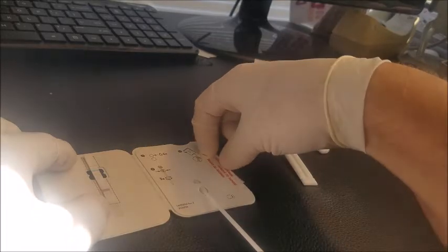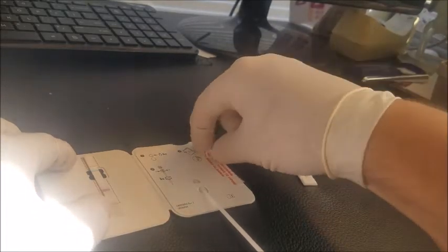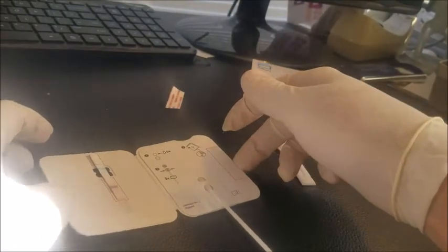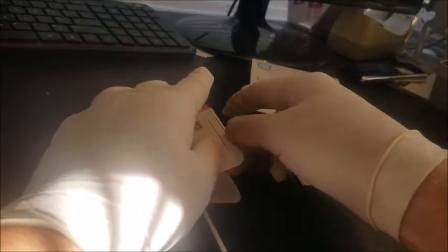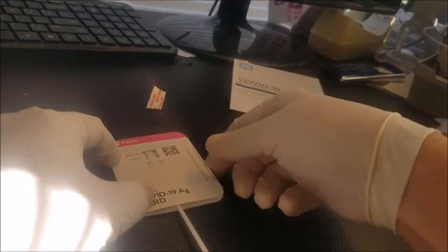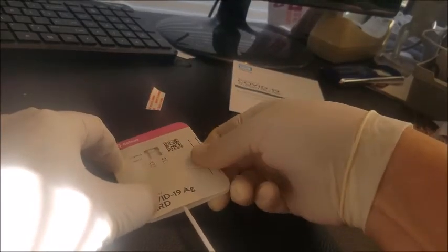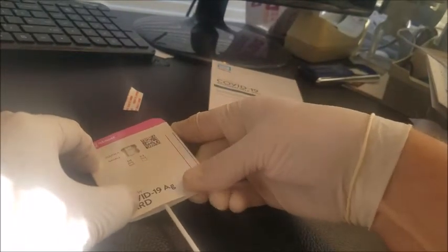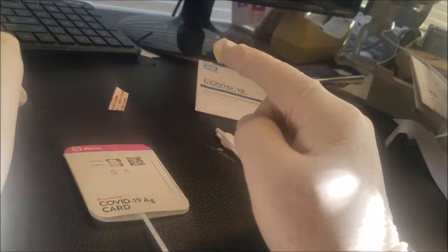Now this self-adhesive sticker here — you're going to take this off. That's going to help close your card. You want to close it and make sure that you firmly press these two lines here to ensure you've got a good, tight fit. And now we're going to give it 15 minutes.